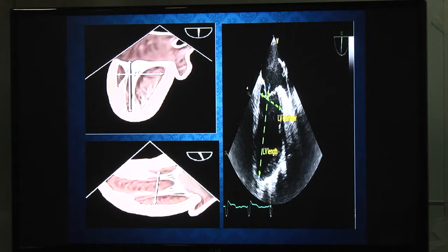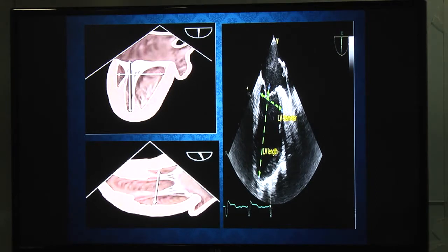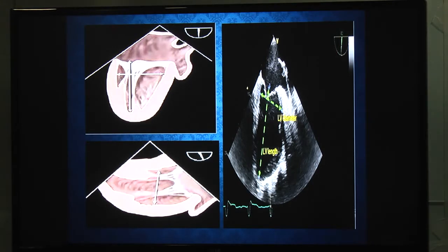Septal wall thickness and posterior wall thickness are recorded in the transgastric short axis view at the mid-papillary level. The short axis of the LV extends below the mitral annular tip and can be measured in the mid-esophageal two-chamber view. The long axis is measured from the mitral annular level to the LV apical level in the two-chamber view, because it avoids LV foreshortening that occurs in the four-chamber view. The short axis can also be taken in the transgastric two-chamber view.